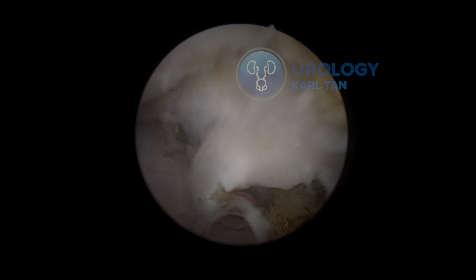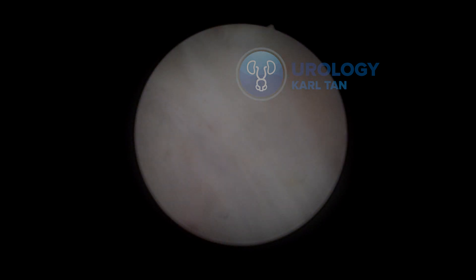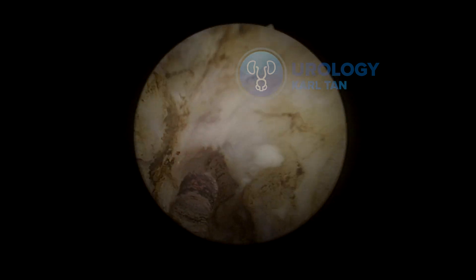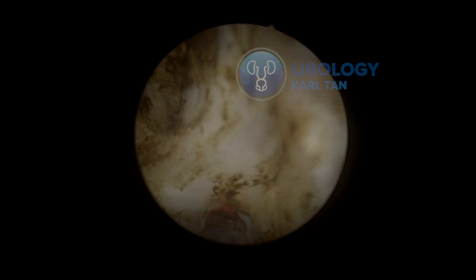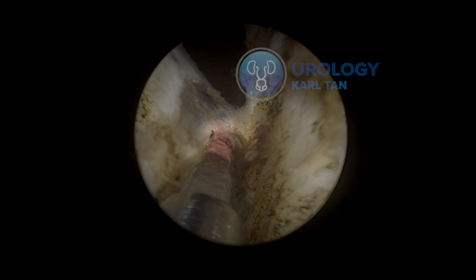For this case, there's a little bit of a sticky part of the prostate, maybe caused by some infection or inflammation. Trying to enucleate the nodule and remove it from the tissue. You can see that part — I wasn't able to remove it and found it difficult to take it out, so I just vaporized it so that it would not add to obstruction if it eventually grows.